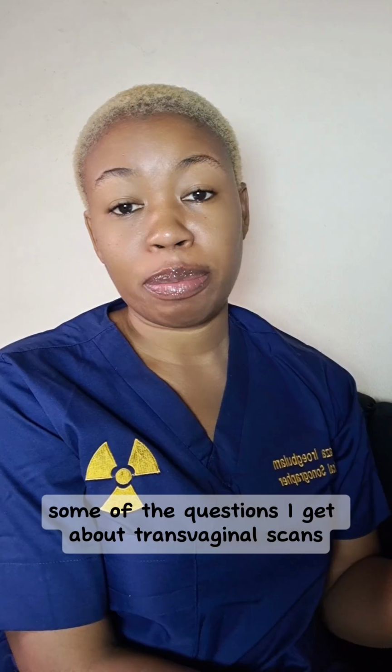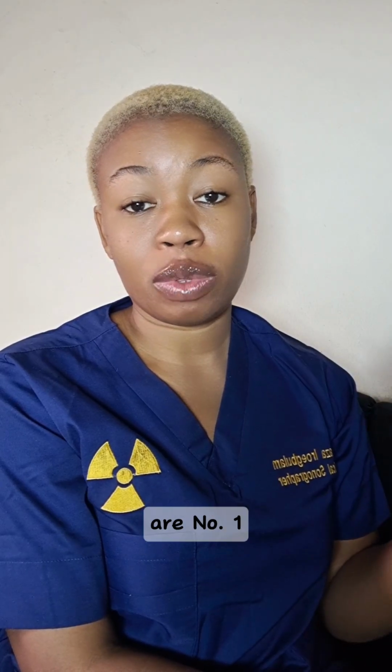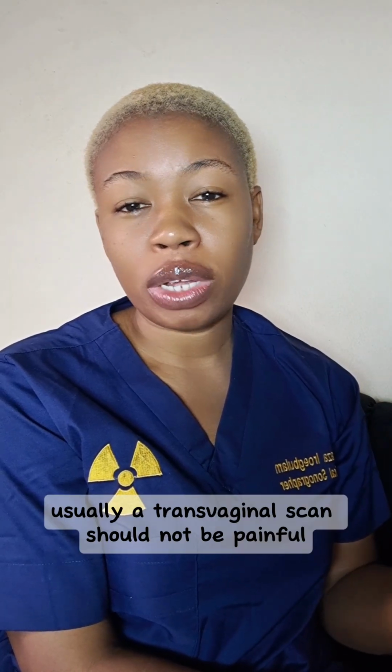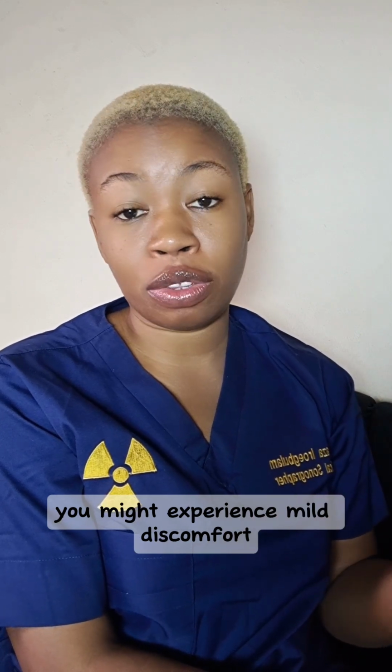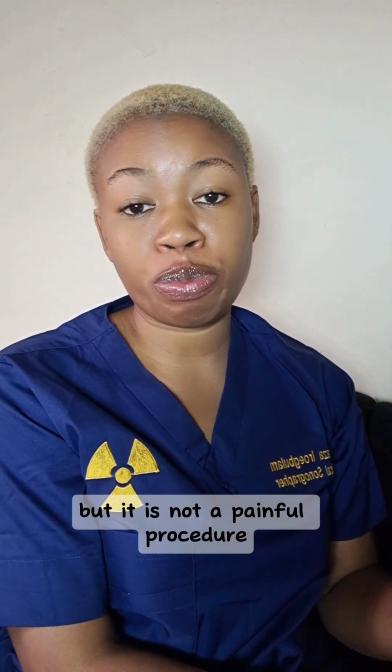Some of the questions I get about transvaginal scans are, number one, is it painful? Usually a transvaginal scan should not be painful. You might experience mild discomfort, but it is not a painful procedure.